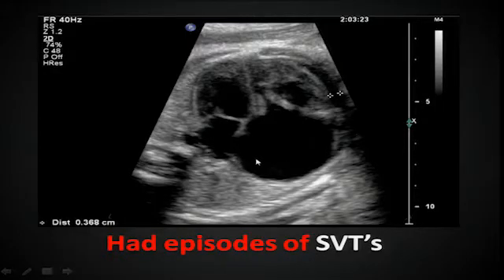Baby, as we were scanning, had episodes of SVT. We've magnified up a little bit, trying to clean up our image. So again, looking at the apex of the heart, left ventricle, left atrium, right ventricle, and looking at the right atrium. So we can see that the heart is occupying more than a third of the chest. So this is an enlarged heart, and the right atrium is the largest part of the heart that we see.